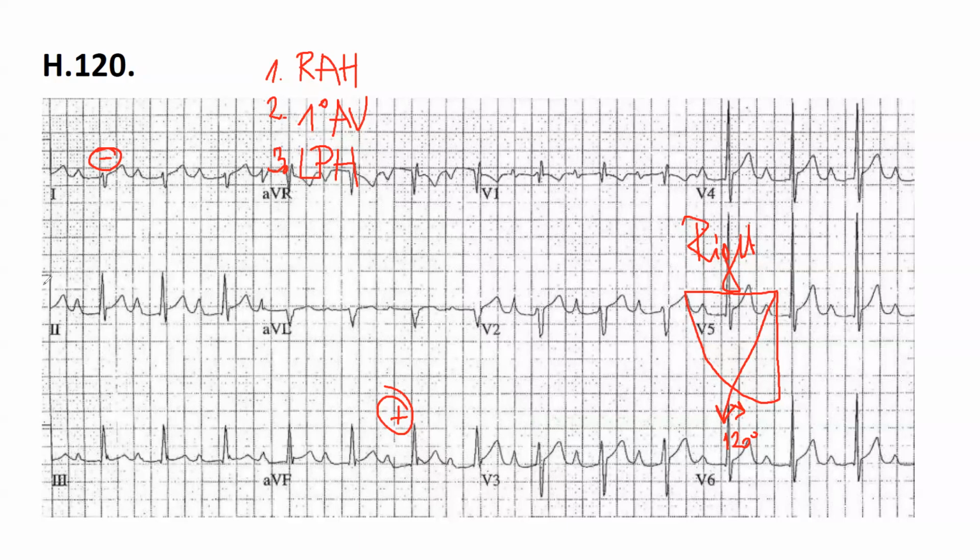What did I say after? Oh yeah, QRS. Pathological Q wave, you can go for. I don't see anything. But you do see this again in V1, an incomplete right bundle branch block. Is it incomplete or complete? It's incomplete. It's not wide. Okay, so far so good.